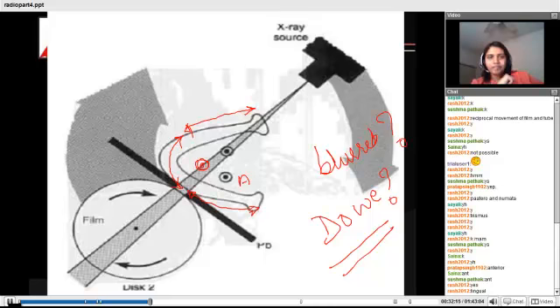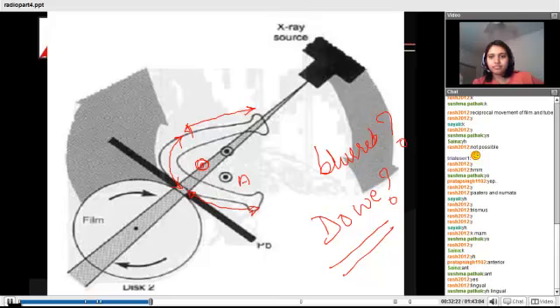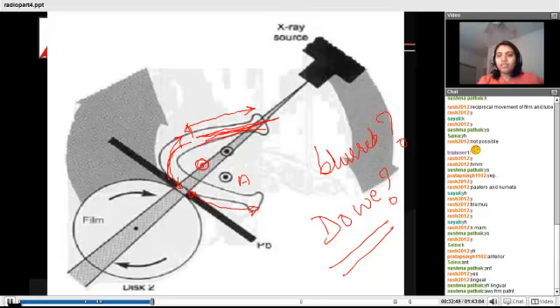What do you say? Feel free to answer, guys. It's okay to be wrong. Why lingual? I may probably fix the center of rotation based on its lingual arc too, if I have to define it. Or usually it's at the center of the crest. Basically, a center of rotation is trying to keep the object which we want to record in focus. So why particularly lingual, say?